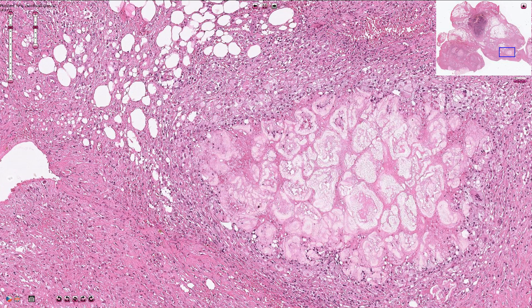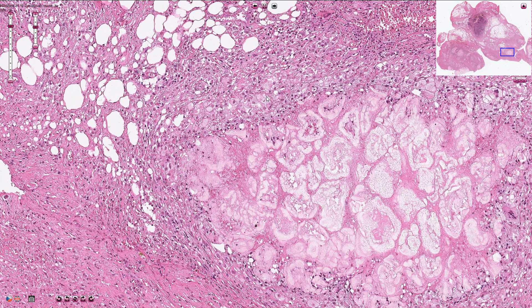Around the fat necrosis we can usually find foamy macrophages and mild chronic active inflammation composed of lymphocytes, plasma cells, and some neutrophils.